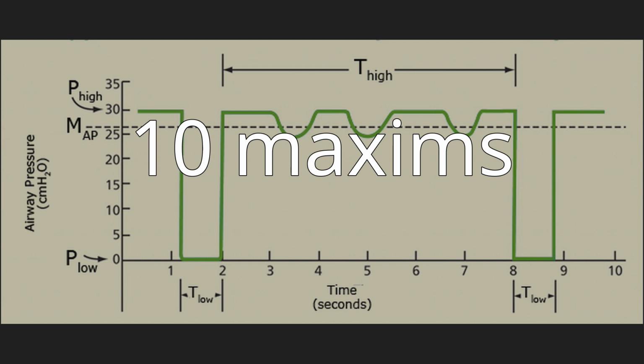Pressure is actually a pressure difference across the system, e.g., transrespiratory pressure defined as pressure at the airway opening minus pressure on the body surface. Elastance is defined as the change in pressure divided by the associated change in volume, the reciprocal of compliance. Resistance is defined as a change in pressure divided by the associated change in flow. Both are parameters assumed to remain constant during a breath.